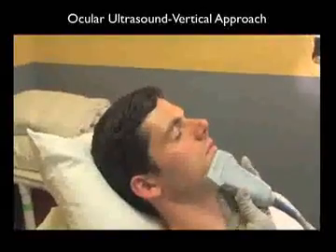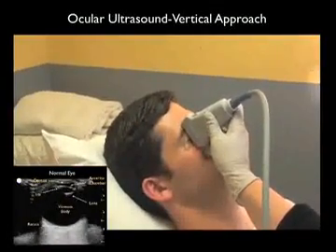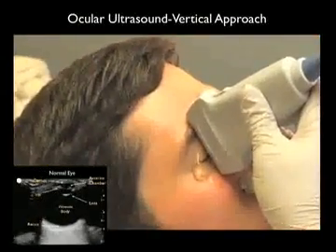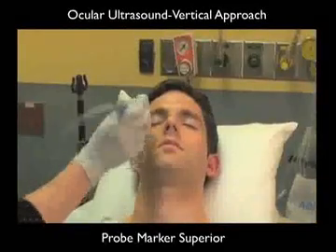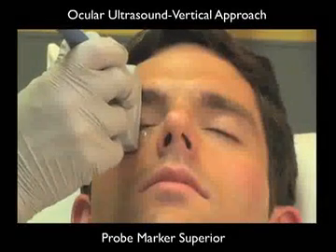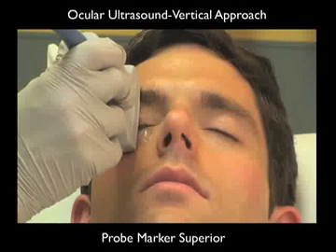To complete our examination of the eye, we should also perform ocular ultrasound from the vertical approach, having the probe in an up and down configuration. Note here, we're again scanning through the closed eyelid, with the probe marker up towards the patient's head. We want to scan from side to side to fully investigate the eye in a second plane for any signs of pathology. For this vertical approach, the probe marker is oriented superiorly. Imaging in two planes will best round out the examination of the eyeball.